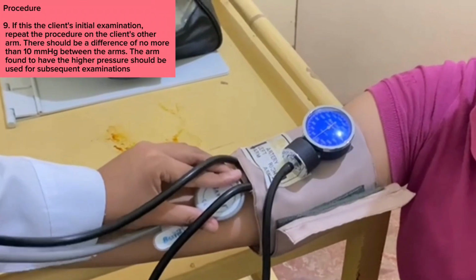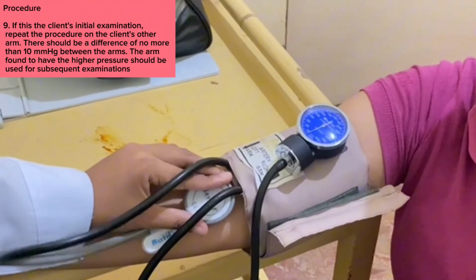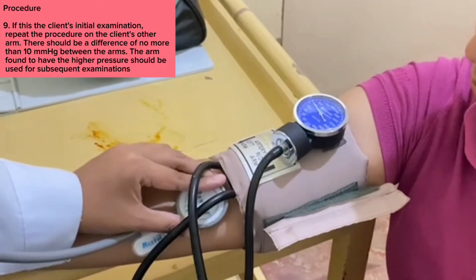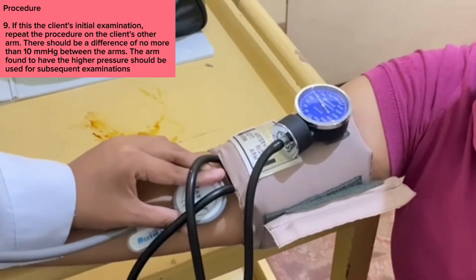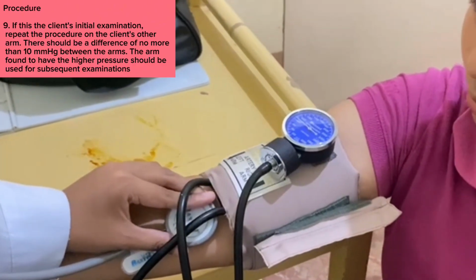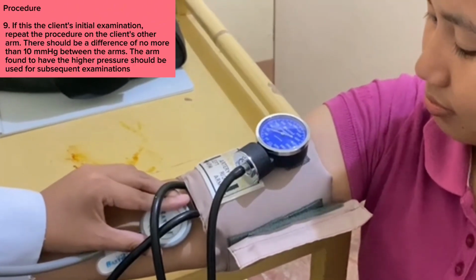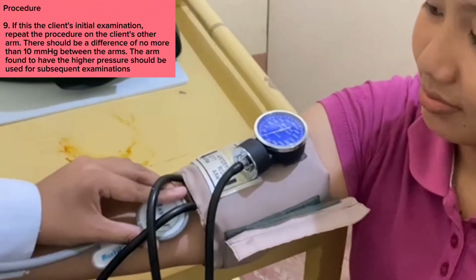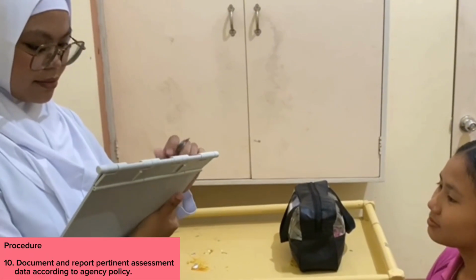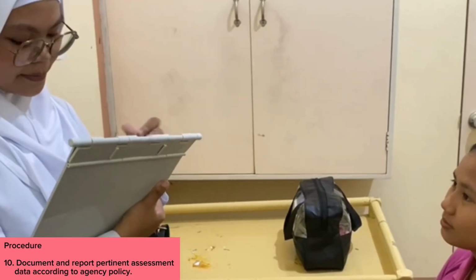If this is the client's initial examination, repeat the procedure on the client's other arm. There should be a difference of no more than 10 mm of mercury between the arms. The arm found to have the higher pressure should be used for subsequent examination. Last, document and report pertinent assessment data according to the agency policy.